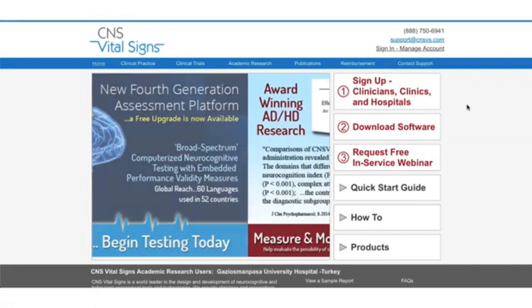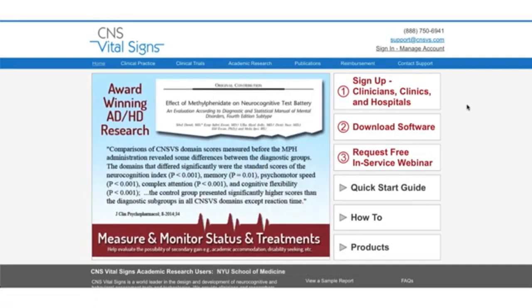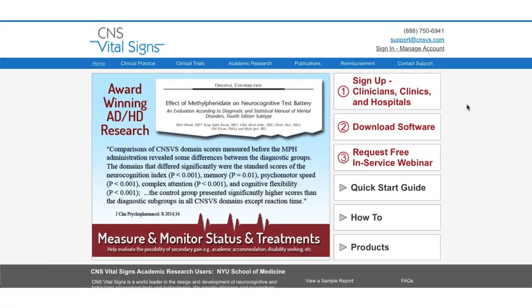Hello and welcome to CNS Vital Signs. In this video I'm going to show you how to create remote testing codes as well as manage codes that have already been created.